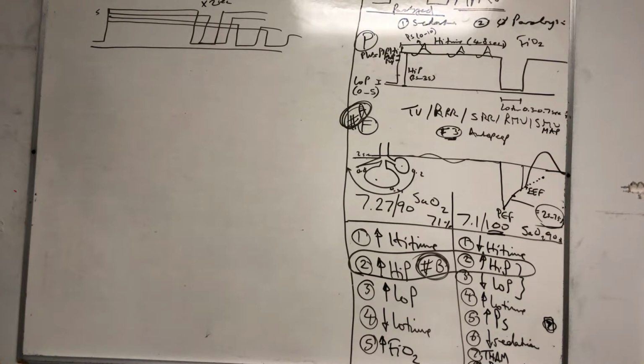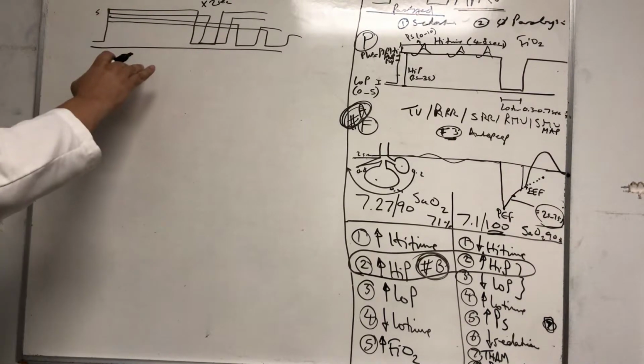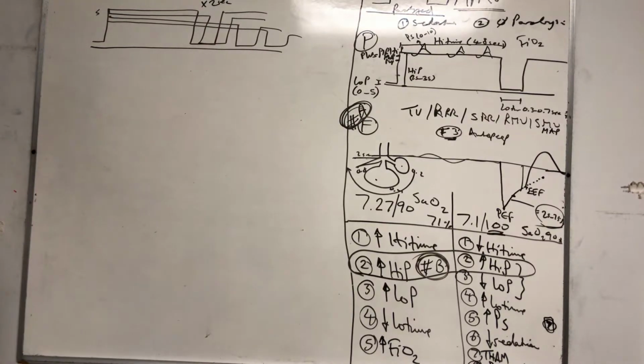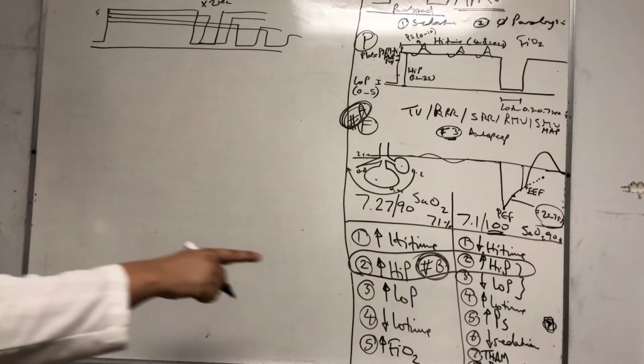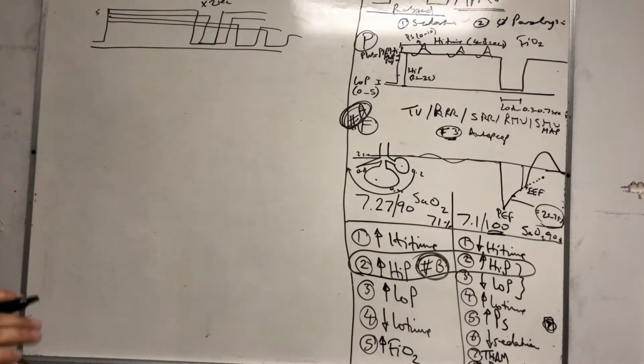You can actually. So what you do is keep going down on the pressures until the pressure is like 7/5, you know, nothing, or something similar to that. And you can actually add pressure support. So this is the peak, it keeps going down until you reach 5 with the high pressure, and then potentially you can start adding pressure support like we talked about when you're weaning the patient. Patient is not complaining too much, you know, not getting anything.